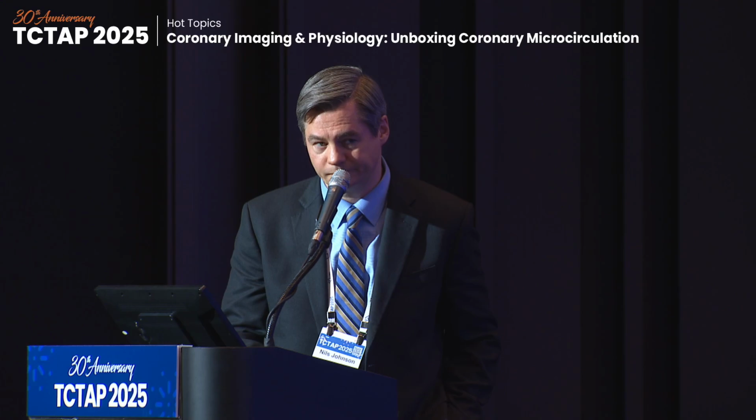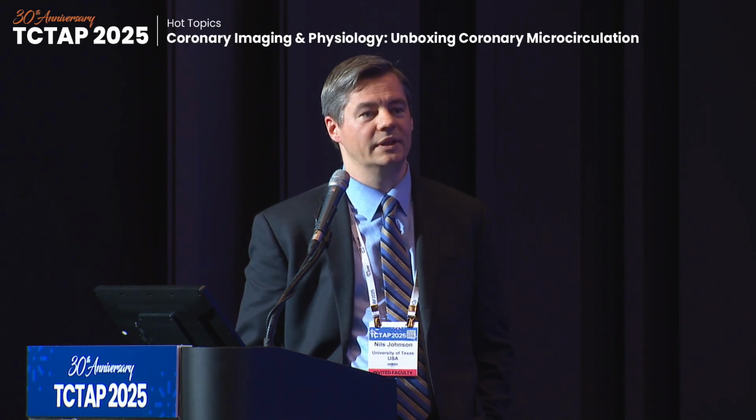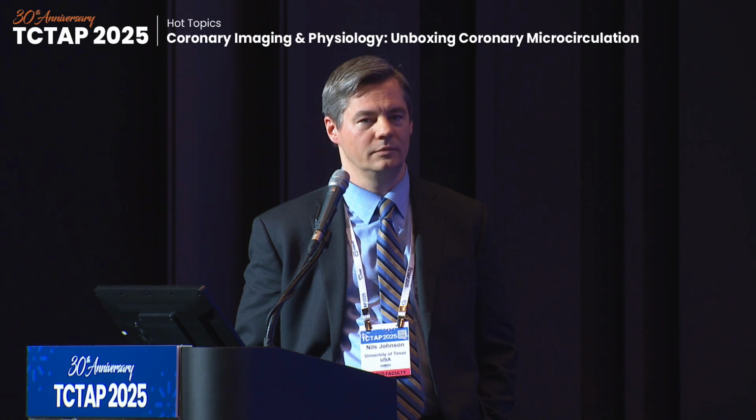So in my practice, PET-CT is the first step. I stopped doing MIBI, and when I still have suspicion for microvascular spasm, isn't that a subgroup that you want to bring to the cath lab? I think that would be a small subgroup to focus on. Sometimes in PET, what people have done in the past also is cold pressor testing as another stimulus to try to induce spasm in patients. We've done a few of those over the years. You can put people's hands in cold buckets of ice and things like that, again, to heighten sympathetic tone and bring out spasm in some of them, as an alternative.